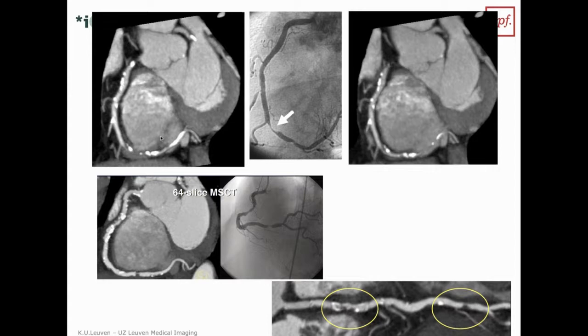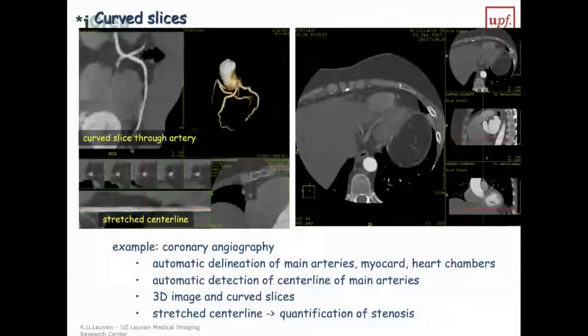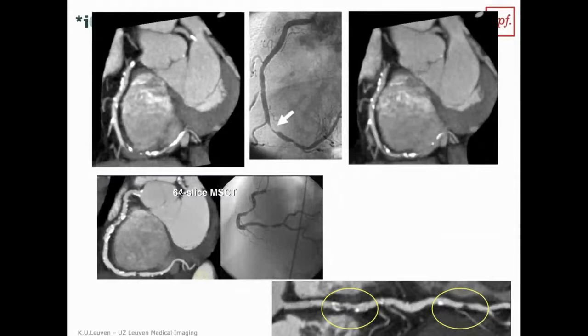So this is one of the things where, again, you have to be very careful to extrapolate things that you measure with imaging towards its clinical meaning. You really have to see whether pathophysiologically these are indeed connected. And then, of course, you should show with large clinical trials or clinical studies that this is indeed the case. And it has been shown that this calcium scoring, although very attractive to use, is not the best in order to do this.